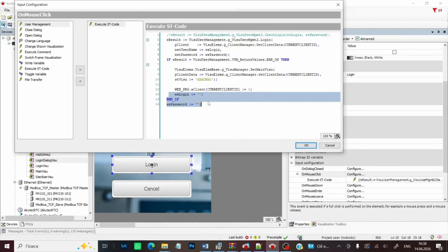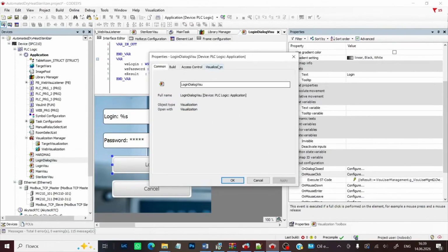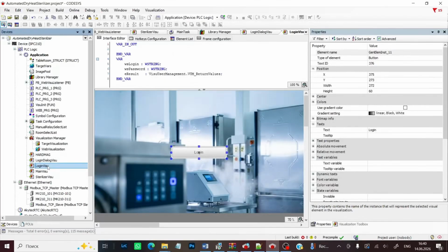But as you can see, if authorization fails, the username will remain and only the password will be reset. In the properties of this visualization, on the Visualization tab, for the Use Visualization As field, I selected the value Dialog and set the width and height of the dialog window. After that, I created another visualization, which will be shown to all unauthorized users.